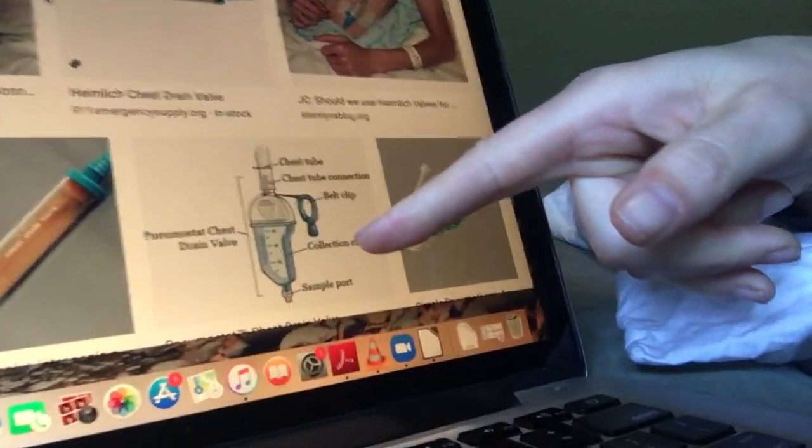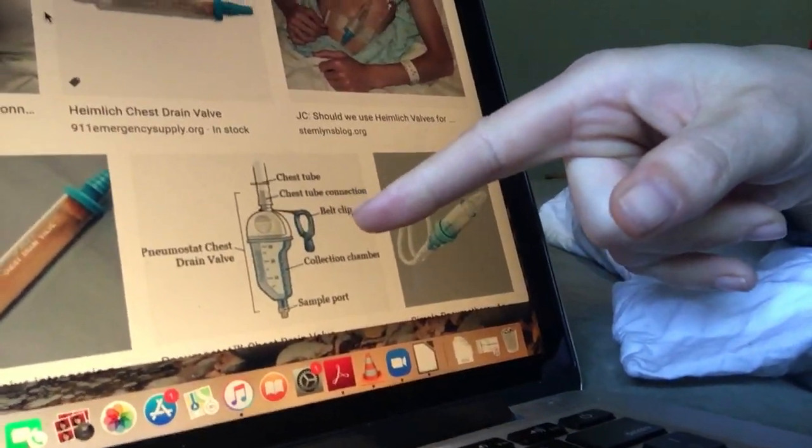But sometimes they are drippy. Occasionally when they're really drippy, the doctors will put on some more unusual things. So you'll see something like this, or like a mini, teeny tiny looking chest tube that'll go on the tip of it. If there's lots of drainage that comes out, we'll do that instead. And they'll go home with those Heimlich valves for a week or two while they're waiting for that lung to seal closed and that air leak to stop.